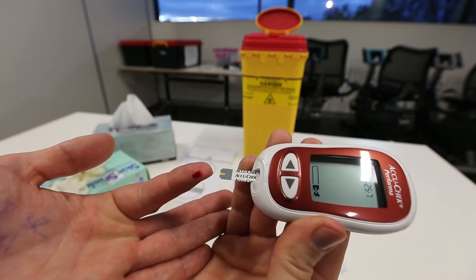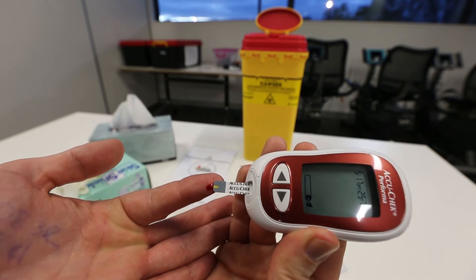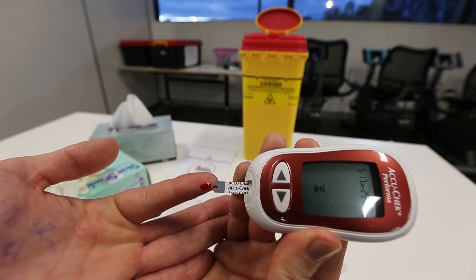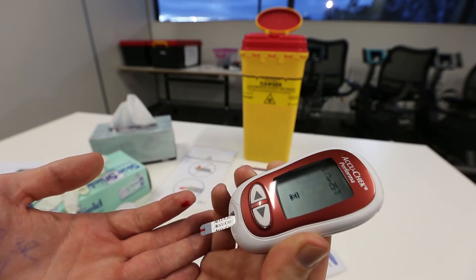When sufficient blood has been drawn into the test area, the unit will beep, and in 5 or so seconds the blood glucose reading will be shown on the screen.